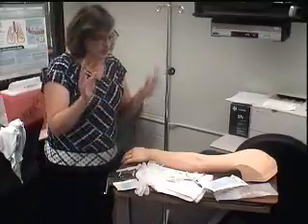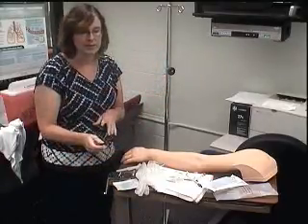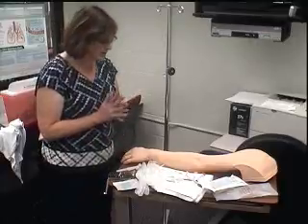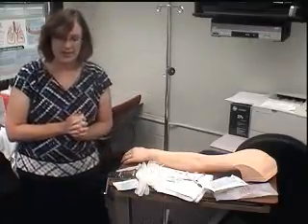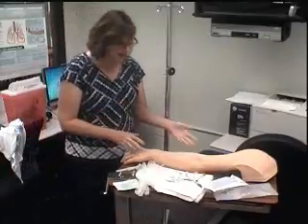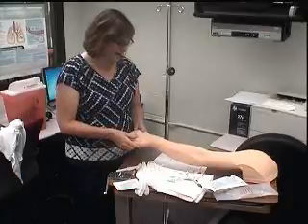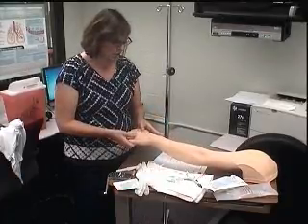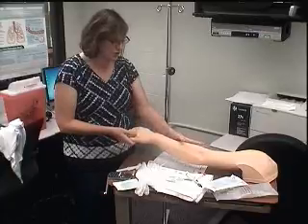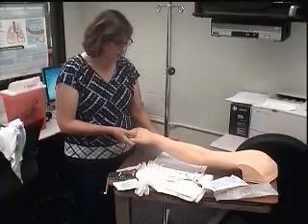Okay, so we would pull out our normal saline out of the Pyxis using our 3 checks, 11 rights, all that. We're also going to be checking the chart for various things that can affect site selection. Let's say they have a dialysis graft, or let's say that there is any disease process. Let's say they have a broken arm, or let's say they have a CVA. You wouldn't want to use the arm that has paralysis.